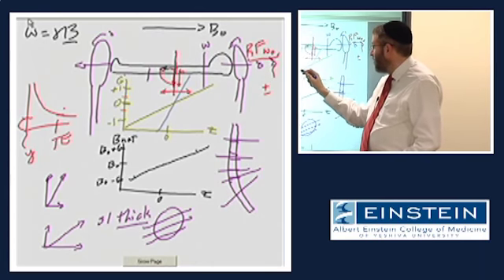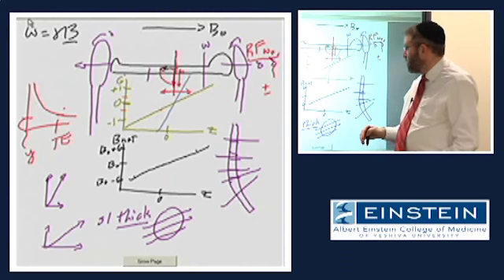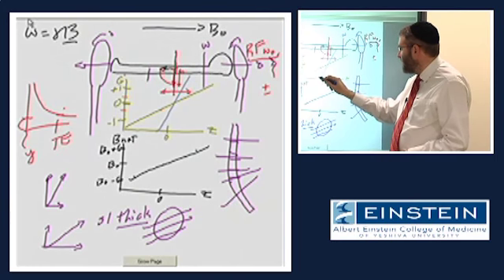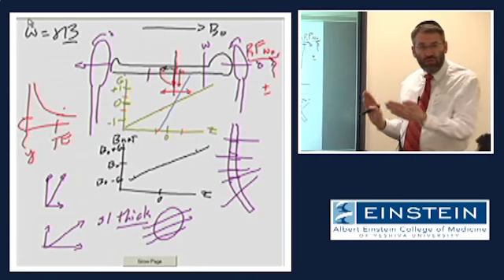So under our green gradient, which has a lower amplitude or a shallower slope, we are going to be selecting this range of tissue, right?